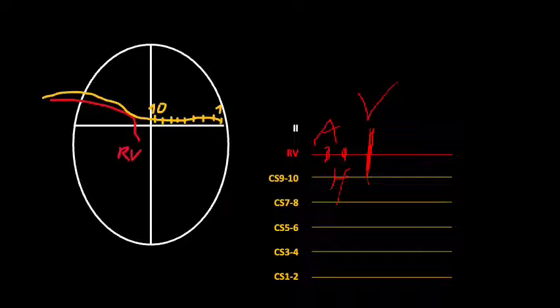So this is important for the next parts of the para-Hisian maneuver to be sure that we are in the good area.